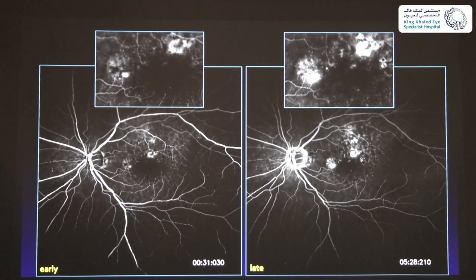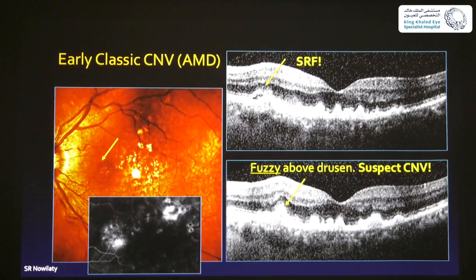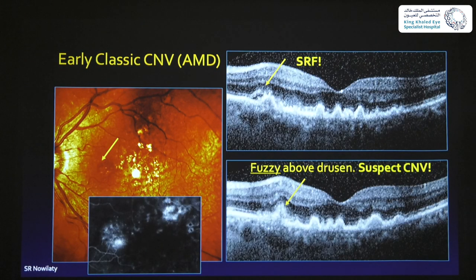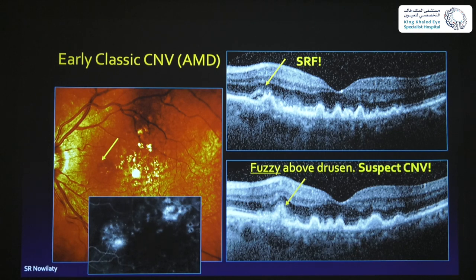Here is a long-term patient case with early and late fluorescein angiogram showing early detectable hyperfluorescence and later leakage. On OCT, this patient has a lot of drusen — elevated RPE with Bruch's membrane visible — and subretinal fluid indicating leakage. This was identified as a very early, tiny membrane in a high-risk AMD patient with many drusen. Treatment was started and the patient continues on anti-VEGF medications. This illustrates how OCT reveals structural changes including subretinal fluid that confirms active neovascularization requiring treatment.